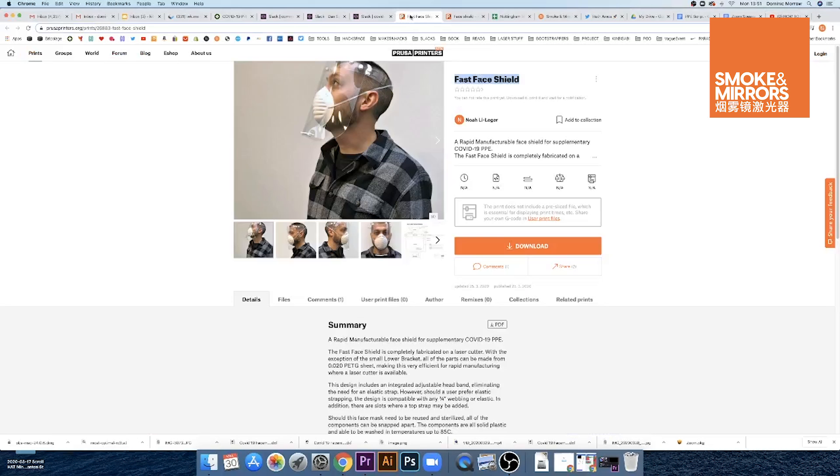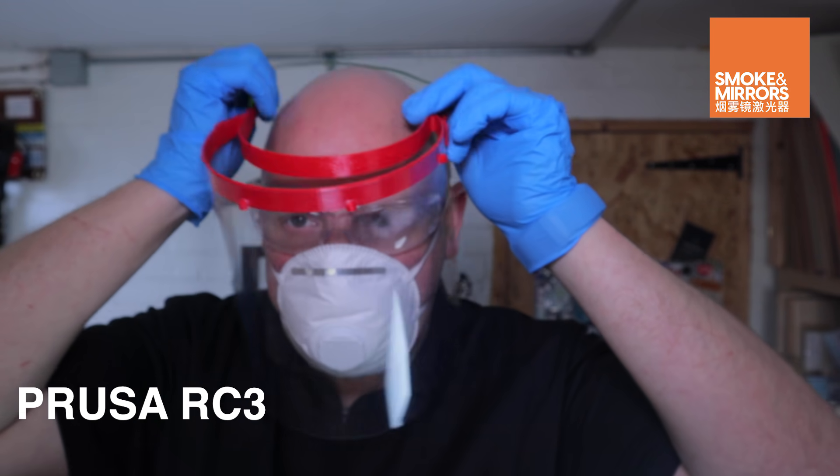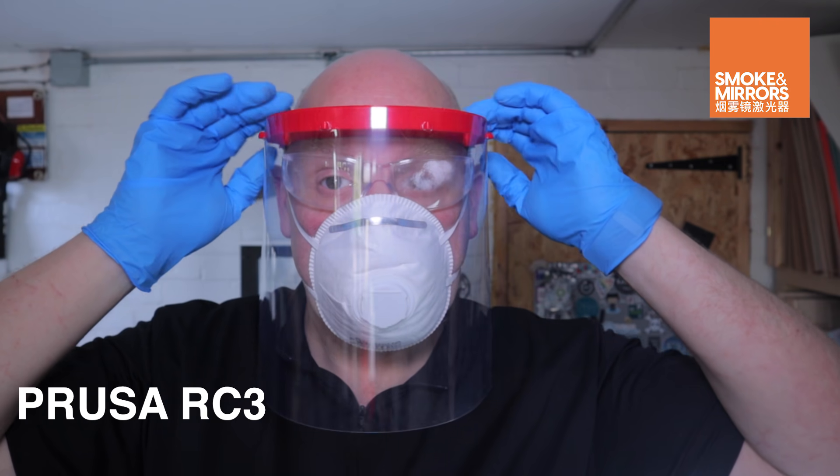The design takes heavy inspiration from Fast Face Shield by Noah Li-Leger on PrusaPrinters.org, that's item number 26883, the Fast Face Shield, and the Prusa RC3 3D printed face shield design which has been iterated by many designers.